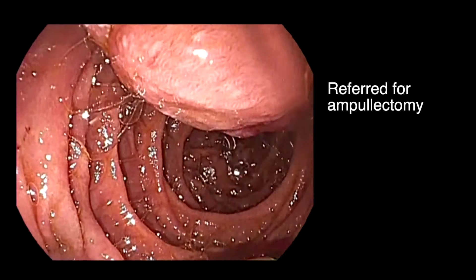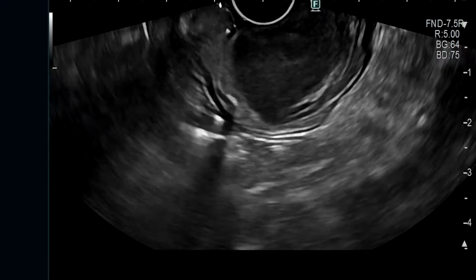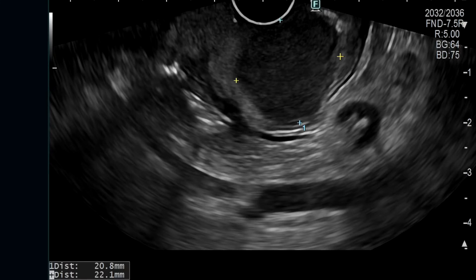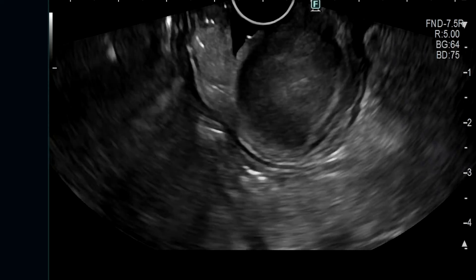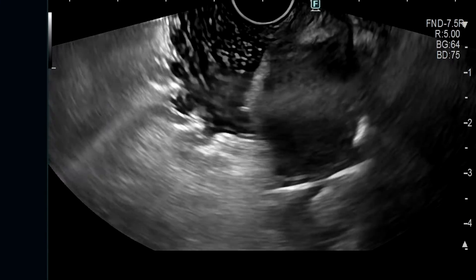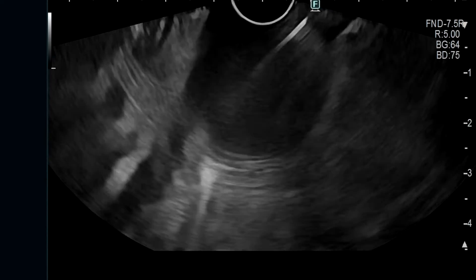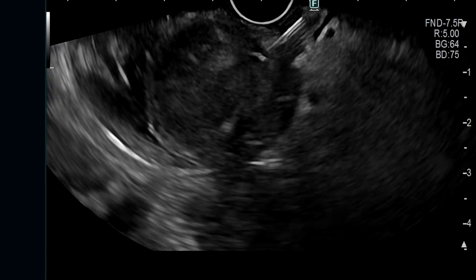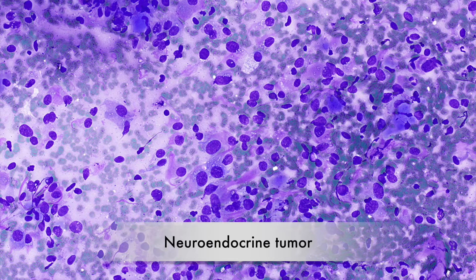A 58-year-old patient was referred for an endoscopic ampullectomy. EUS revealed a mass involving the superficial and deep mucosal layers. The submucosa was well preserved and the common bile duct and pancreatic duct were spared. It cannot be overstated how important it is to instil water for thorough examination of the wall layer origin of a lesion. Fine needle biopsy revealed the lesion to be a high-grade neuroendocrine tumour and the patient underwent a Whipple procedure.